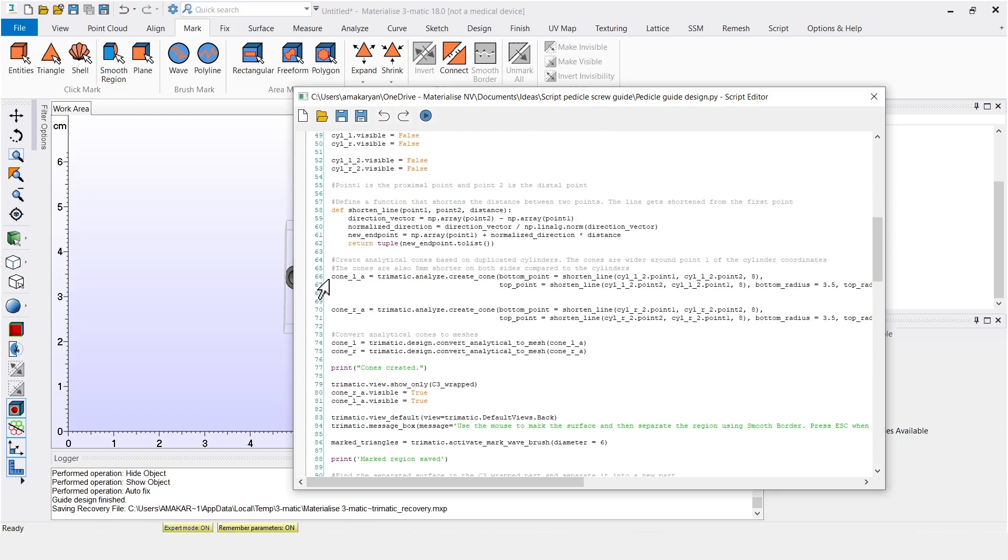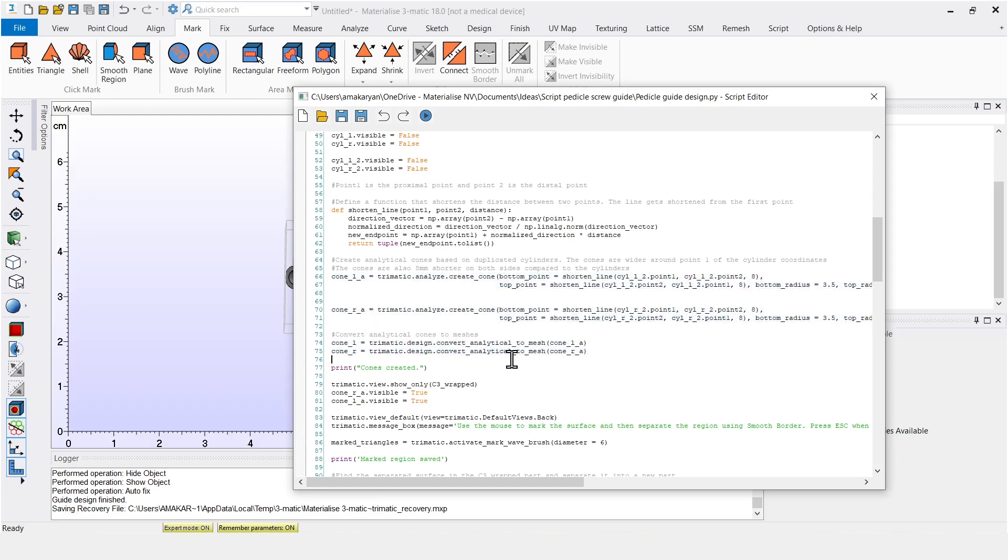Next we create cones around the positions of the screws. And if we take a closer look at the code, some methods correspond directly to the tools in 3matic, like create cone or convert analytical to mesh.